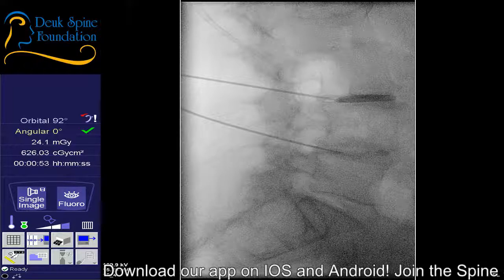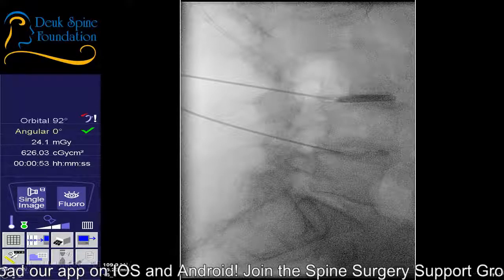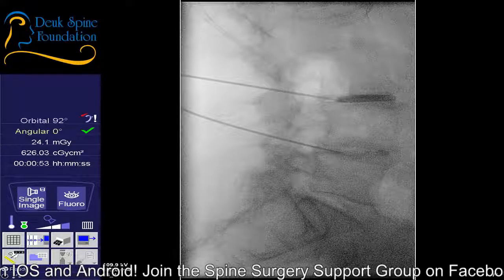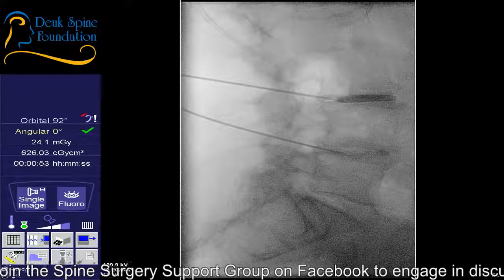Sometimes the needle will grab the guide wire because the tip of it may be bent a little bit, or you may get some soft tissue wedged in there, and when I pull the needle out, it'll actually pull the guide wire out. So you don't want to do that. So I hold the guide wire in position as I bring the needle out, and of course constantly checking.